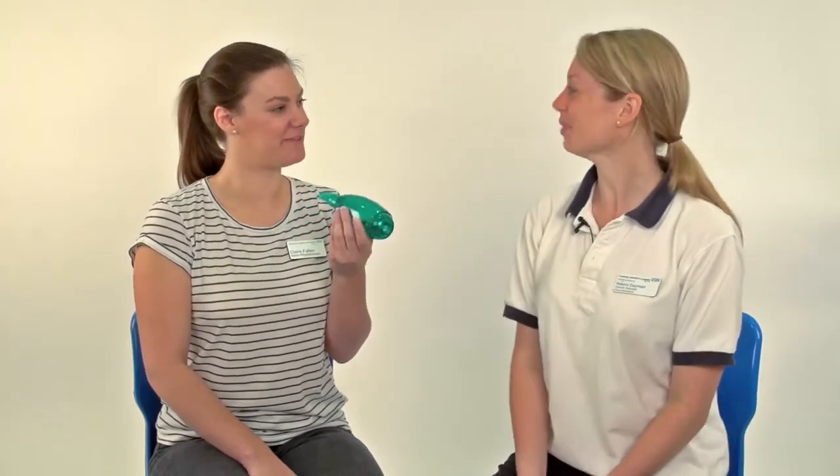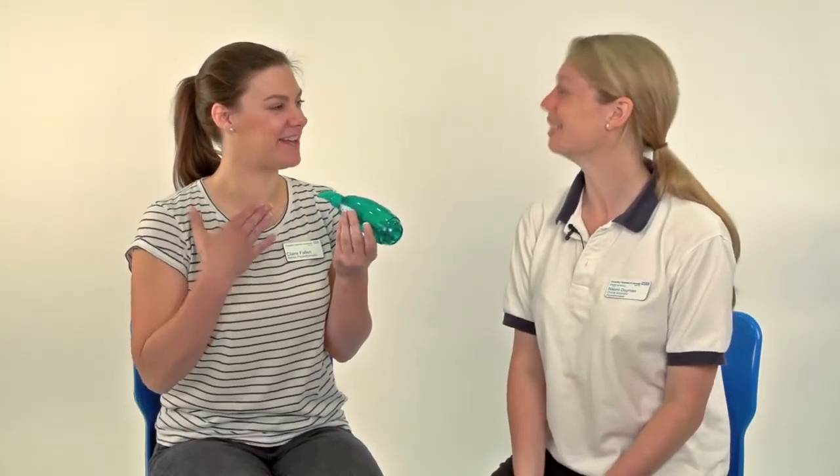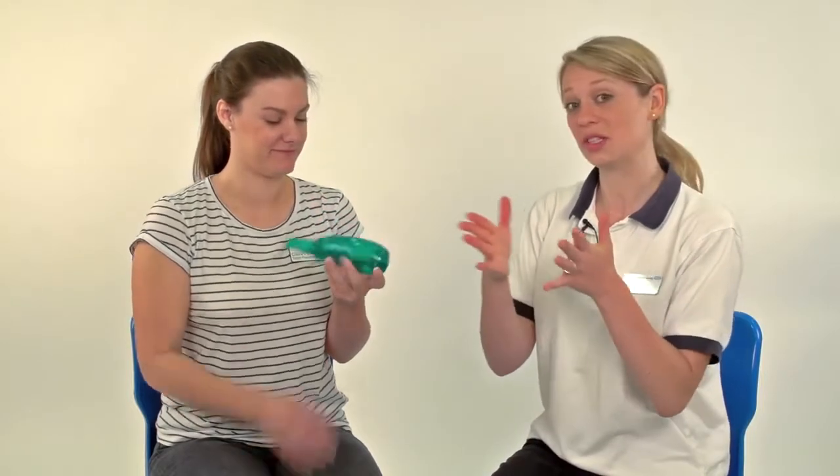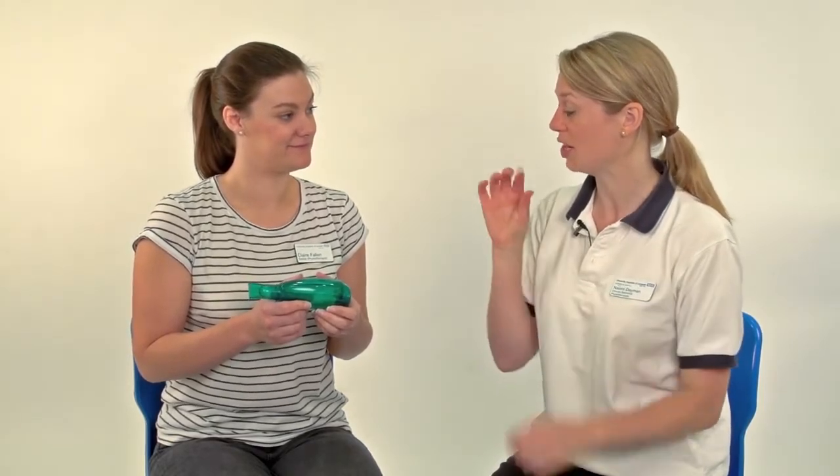It feels very strange. Strange in what way? Just the wobble — it feels like I can feel it right here. That's good. So the wobble helps to move any of the secretions along the airways. You've got a really good technique — you're keeping a good seal in your mouth and blowing out nice and long, and you can hear it makes a bit of a funny noise. For some younger children they quite like this choice of airway clearance device because it makes a funny noise and it's a bit more fun, but it's very dependent on the patient and their clinical presentation as to which choice we use.